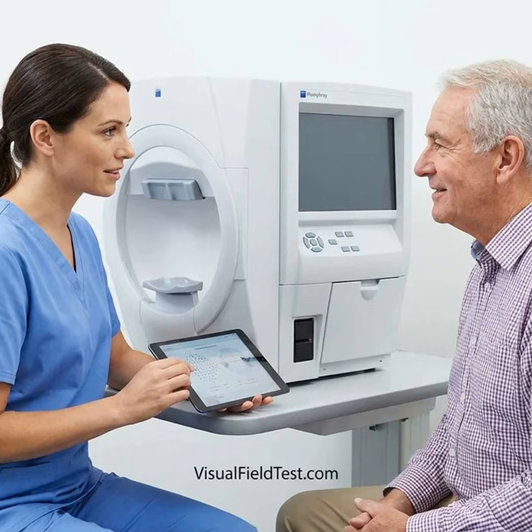A more recent home monitoring study using a web-enabled perimeter found that test duration decreased from 10.04 minutes to 8.31 minutes over 6 months, suggesting that repeated home exposure may improve efficiency. Participants also rated the home system favorably for stress relief and visual comfort. Summary comparison. For the full table, please open this article on visualfieldtest.com.